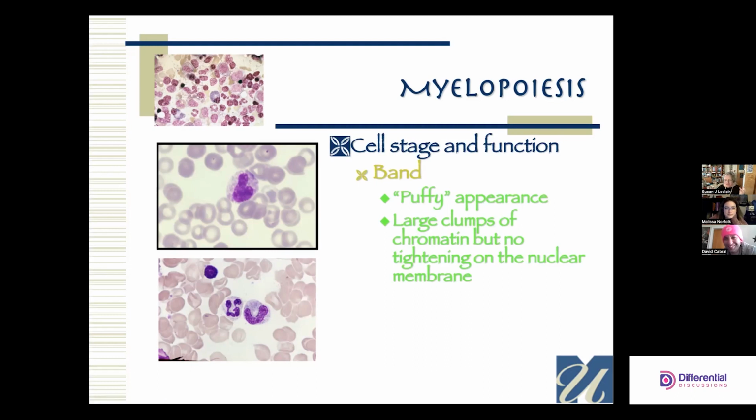They're like those big long balloons that you get at the fair that are straight. No, they're puffy, they're sausage-like. Their nuclear membrane here is thin. Yes, you have a couple of large aggregates of heterochromatin here, but in essence, that nuclear membrane is relatively smooth. And there's some euchromatin that's here.